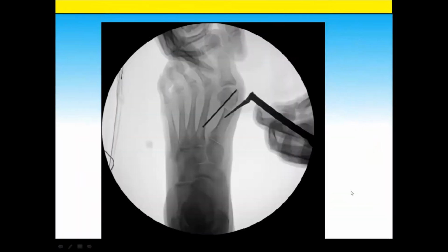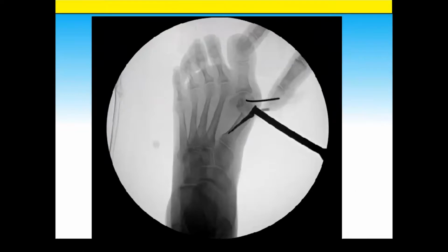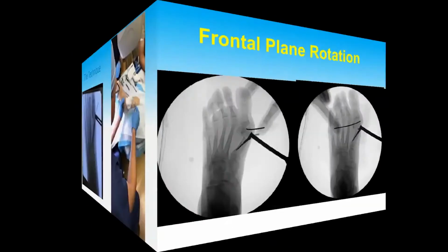Here's just an example of sliding in the implant. You can see checking and confirming on the AP X-ray that I'm in the canal, and then sliding it up the canal to the level of the neck of the implant, which is at the level of your osteotomy. Here you can see kind of clinically how it looks. We're sliding it in and then pushing it in further.